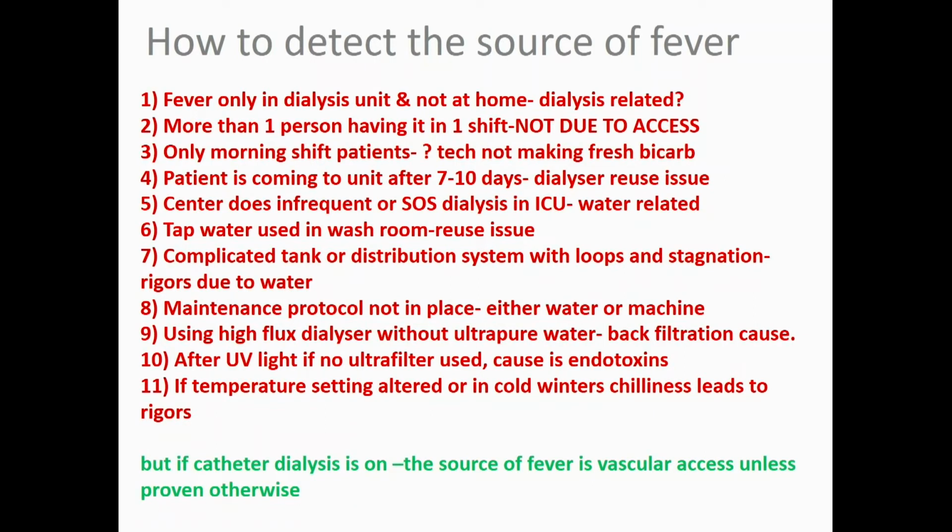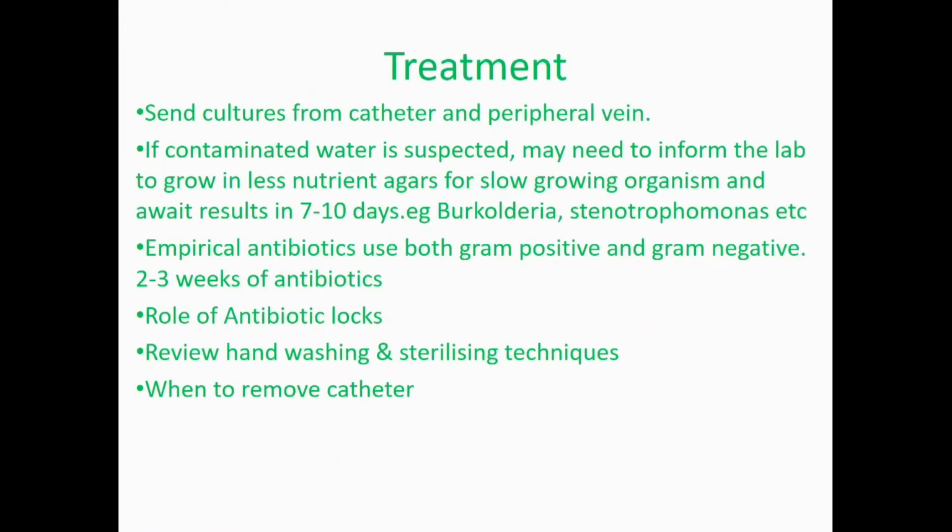Good point, Dr. Hegde. Well said, sir. Only one thing, as you said, the winter, even the summer may be a problem because the machine has a heating but not a cooling. So even very high degrees like 43, 44, then we may have problems. Everybody, you said, it is not the patient's problem, it is the unit problem. So the heating water may be very hot, so it is not cooled completely. You may get a fever at the end of dialysis. It may last for around 2 to 3 hours.